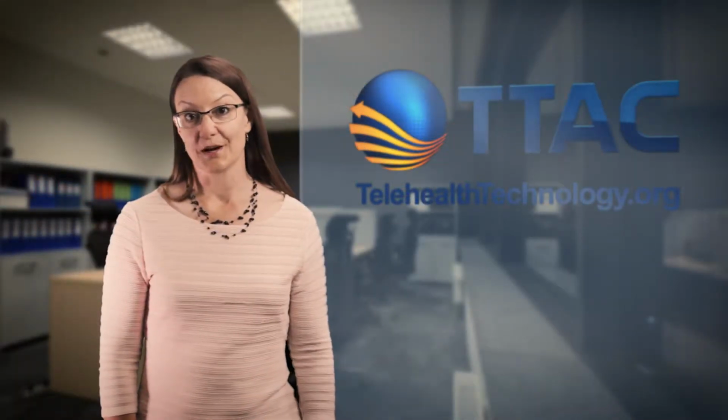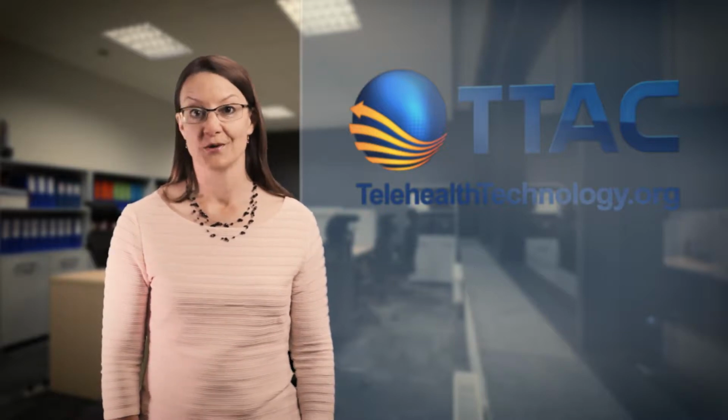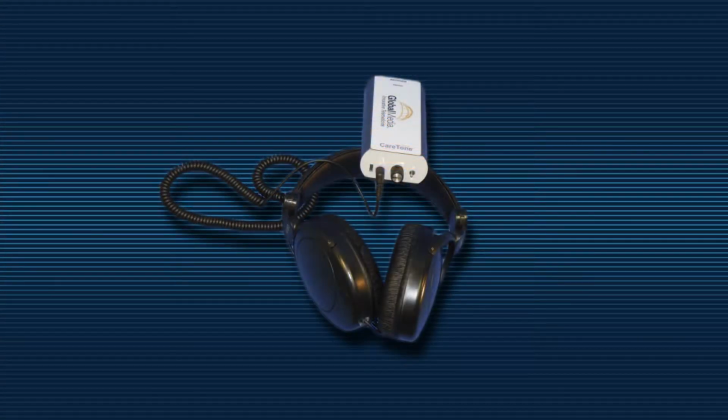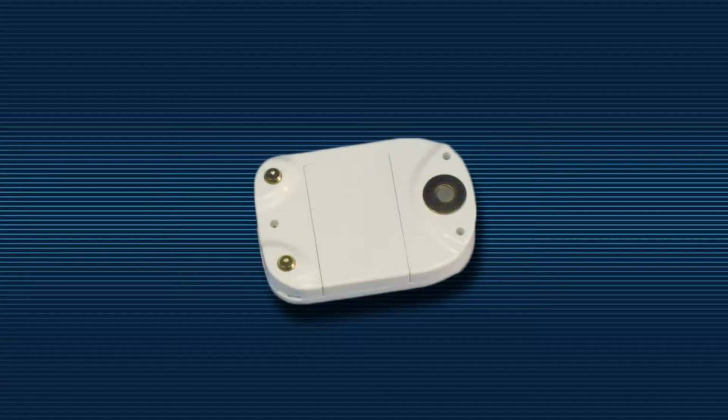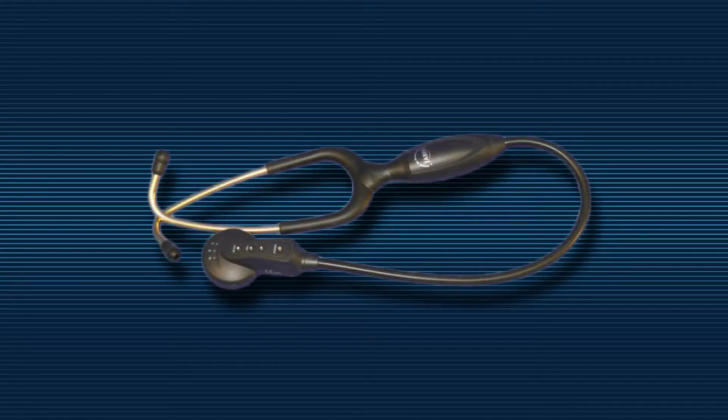It's pretty simple to set up an in-band stethoscope connection because the Steth acts as your microphone and there is less tinkering to do with an outside feed. You just plug the stethoscope into your microphone input on your video teleconferencing system of choice and use that audio input for transmission to the distant site.